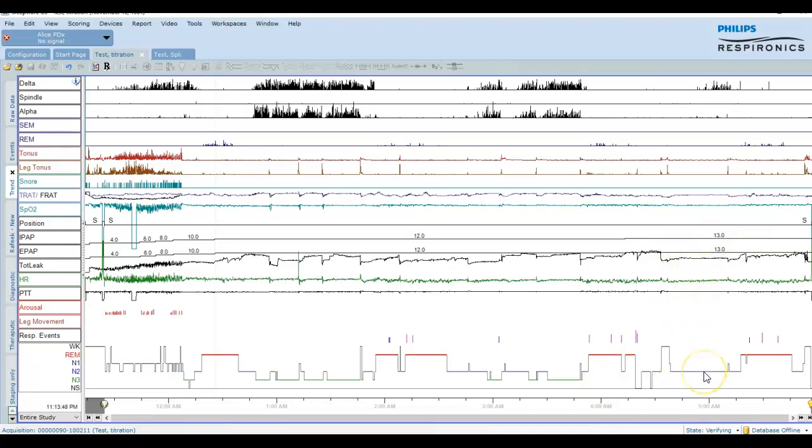This patient had a very severe diagnostic study, which means that AHI was 60 plus. The lowest saturation noted was 65 or something like that, and the patient spent his oxygenation level below 90 percent for more than 25% of the total sleep time. So it was a very severe study in terms of the AHI, severe in terms of the hypoxemia, and he is having very severe excessive daytime sleepiness, as mentioned by a sleepiness score of 20 or more.